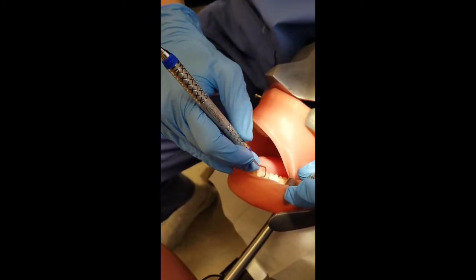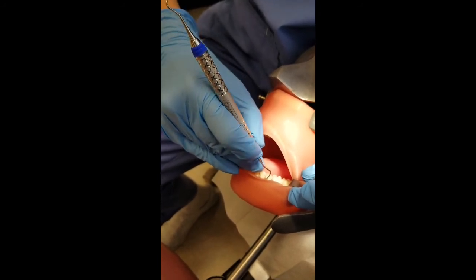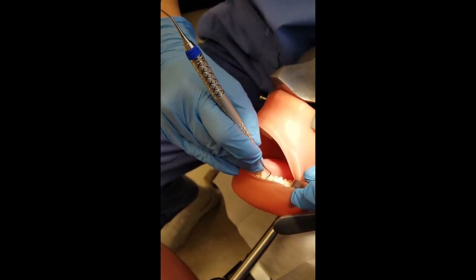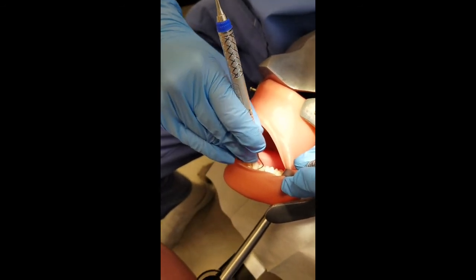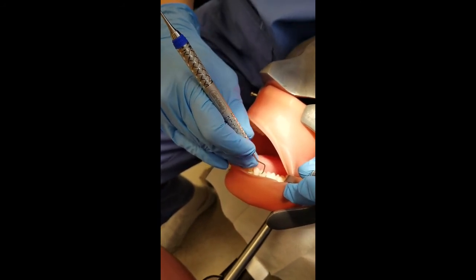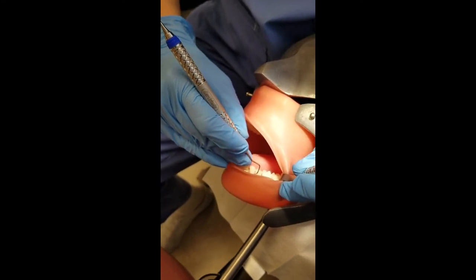Once you get to the mesial line angle, you're going to do a big distal rock to explore, which is less than 45 degrees, and use a little mesial rock to scale at 70 to 80 degrees. You're going to make sure that the terminal shank does not go past parallel. Roll your instrument to maintain adaptation at the line angle. Once at the contact area, back the handle out with the tip being the last to exit.